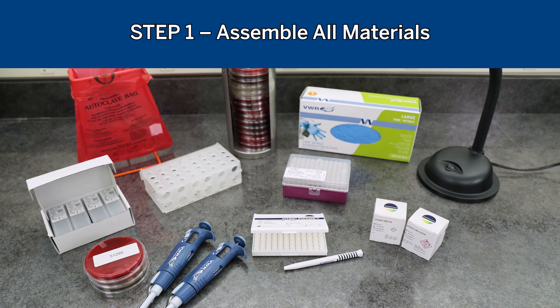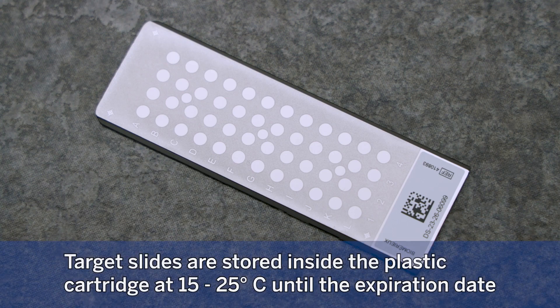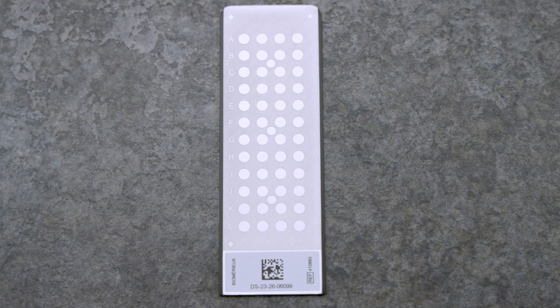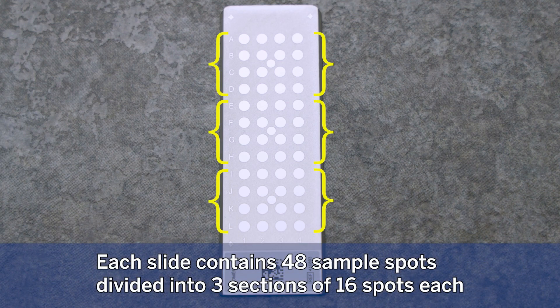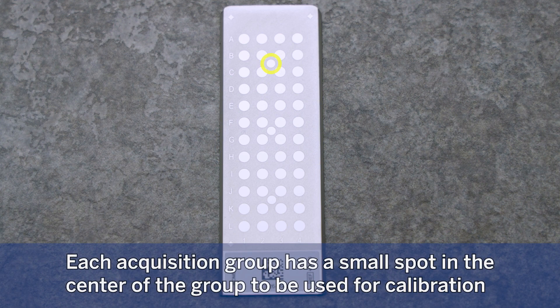Step 1: Assemble all materials. Vitec-MS DS target slides are stored inside the plastic cartridge at 15 to 25 degrees Celsius until the expiration date. Each slide contains 48 sample spots divided into three sections of 16 spots each. Each section is called an acquisition group, and each acquisition group has a small spot in the center to be used for calibration.